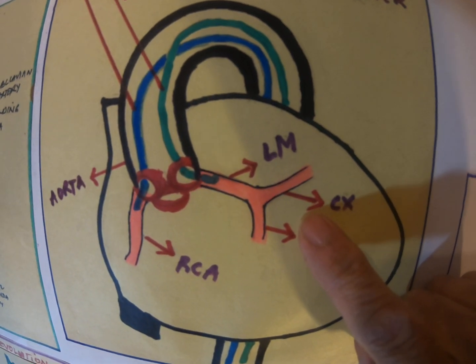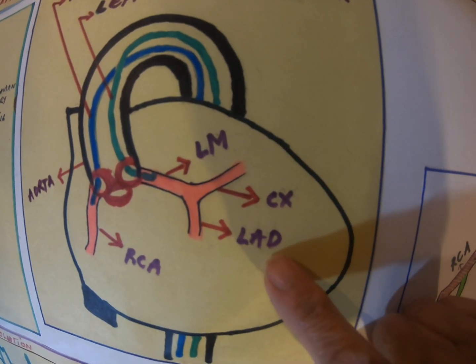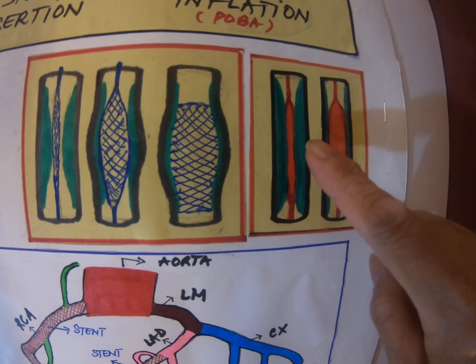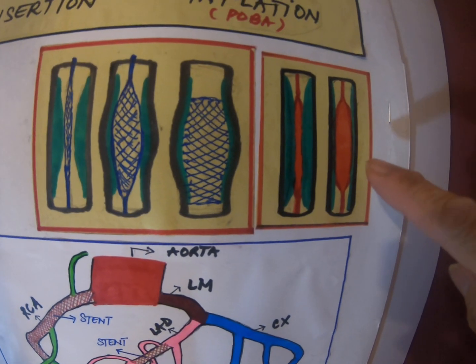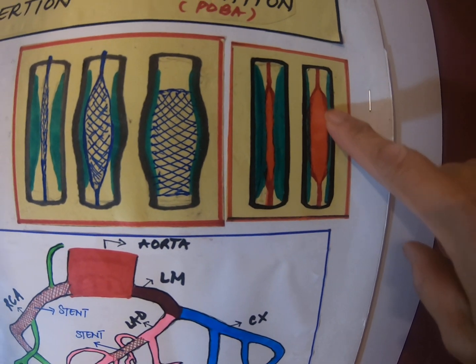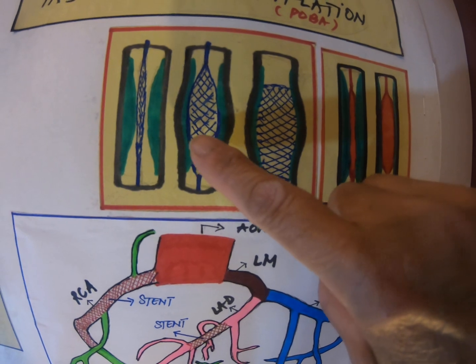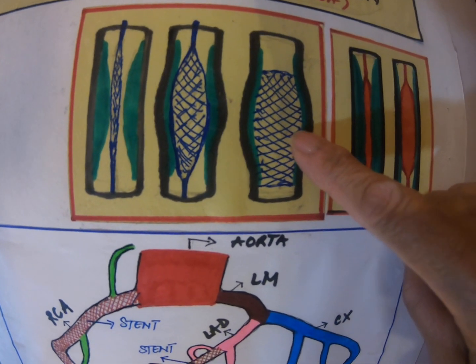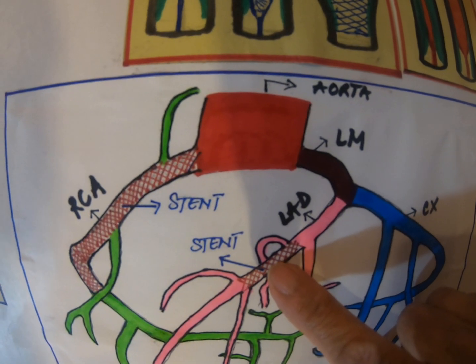But first, he will thread in the balloon catheter. They found that there's a blockage there, let's say in the left anterior descending artery. So he will put in the balloon catheter, and that catheter will be between this plaque, compressing it as he inflates and inflates more. After that he will deploy or put this stent inside the balloon catheter right here, inflate the balloon and the stent, and then leave the stent in place. Let us just say this is the left anterior descending artery that has a blockage and had a stent put in place.